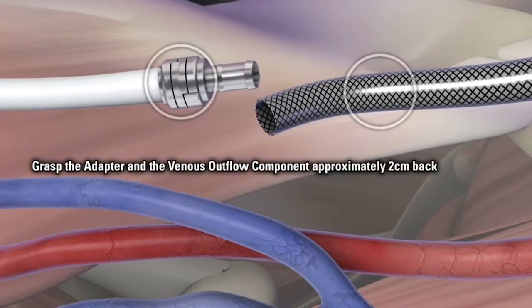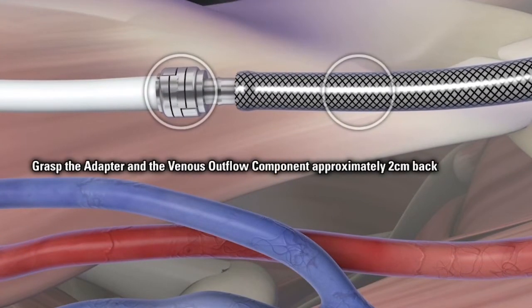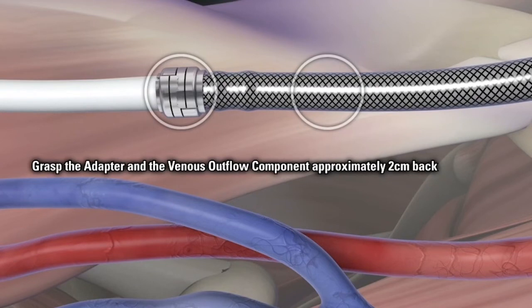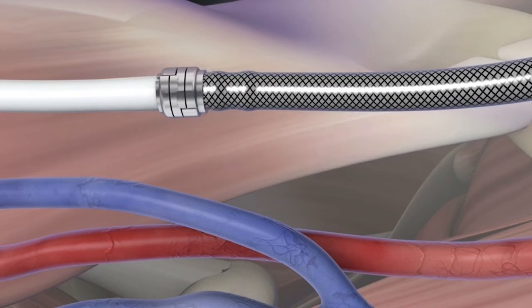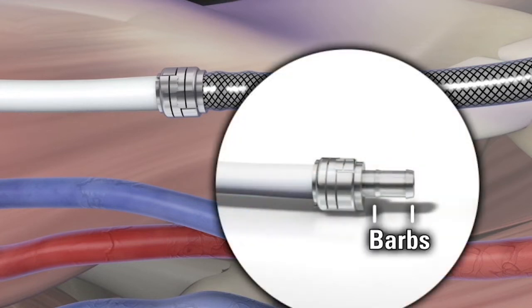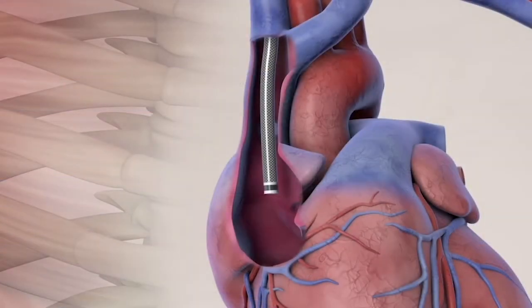Hold the adapter and the venous outflow component approximately 2 cm from the cut end. Push the venous outflow component over the barbs of the adapter's venous outflow component end. The venous outflow component must advance over both barbs of the adapter's venous outflow component end. After connection, verify the position of the venous outflow component.